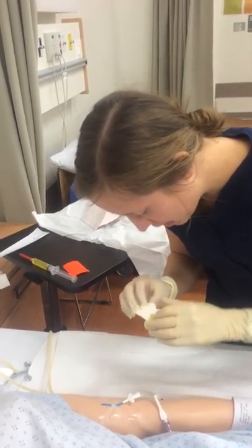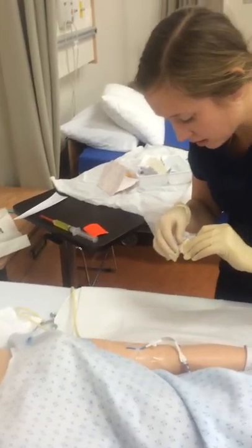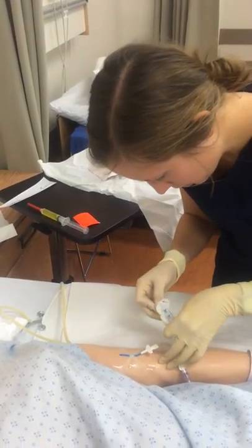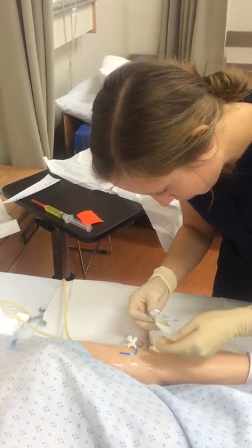And now I'm going to apply my stat lock. And of course these are new stat locks, even from what we had in Sim on the Thursday.